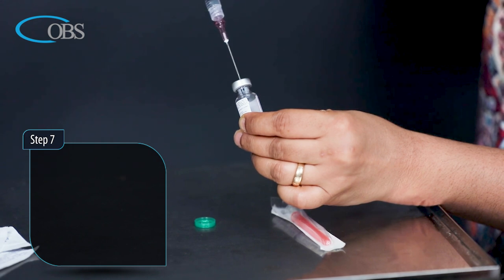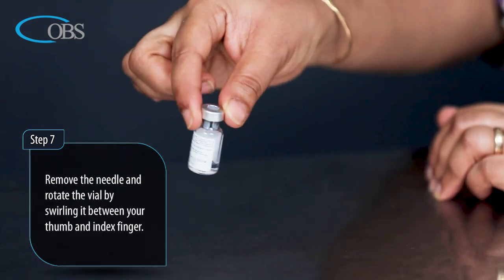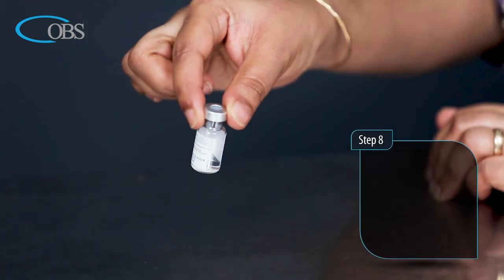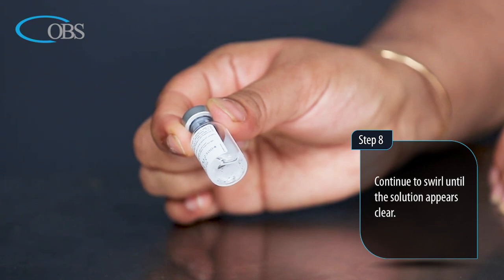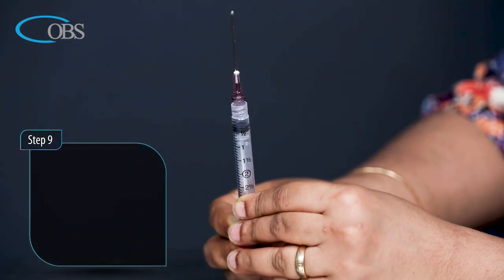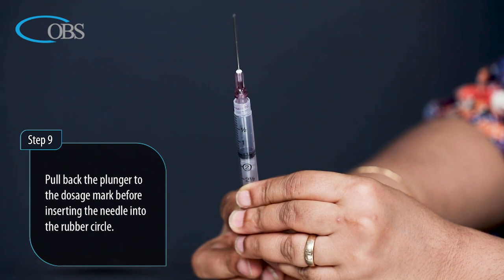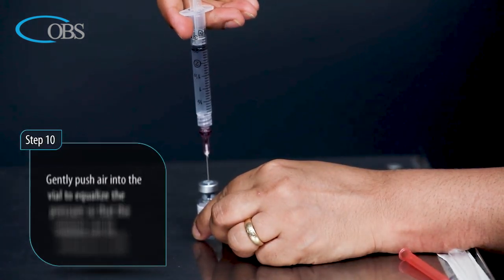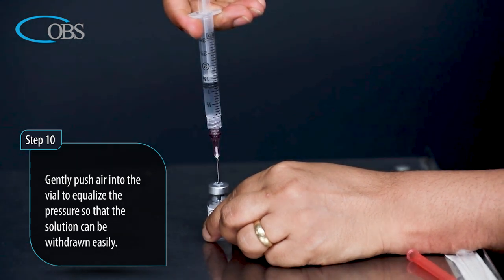Step 7: Remove the needle and rotate the vial by swirling it between your thumb and index finger. Step 8: Continue to swirl until the solution appears clear. Step 9: Pull back the plunger to the dosage mark before inserting the needle into the rubber circle. Step 10: Gently push air into the vial to equalize the pressure so that the solution can be withdrawn easily.